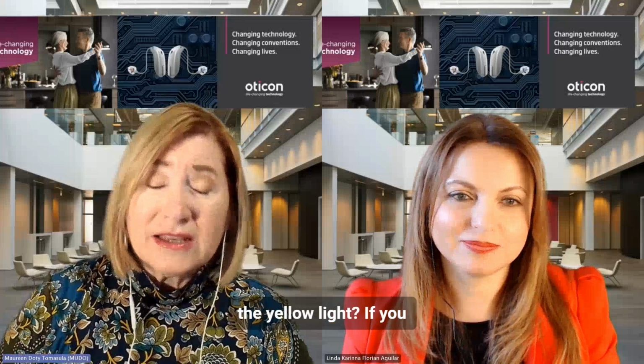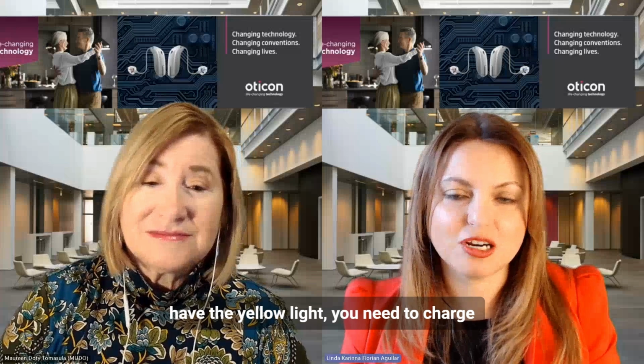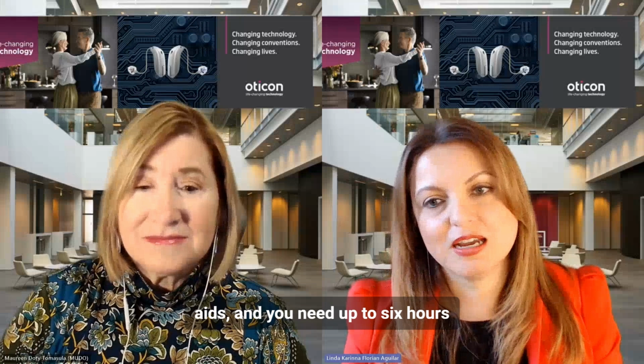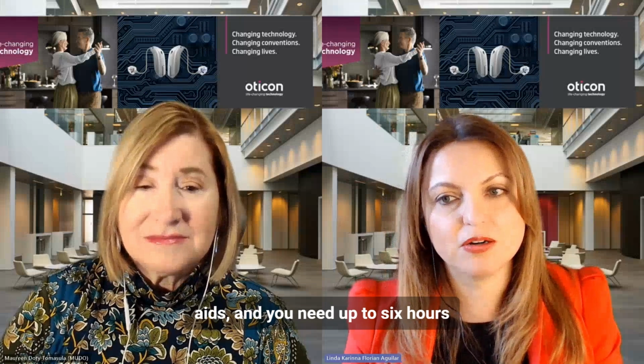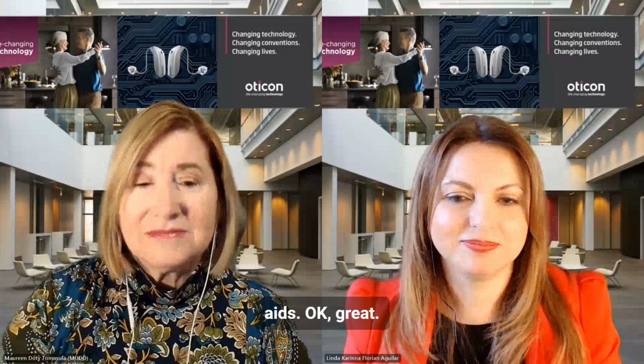So Linda, how long does it take to fully charge the charger with the hearing aids if you have the yellow light? If you have the yellow light, you need to charge the power bank and the hearing aids, and you need up to 6 hours for charging the power bank plus hearing aids. Okay, great.